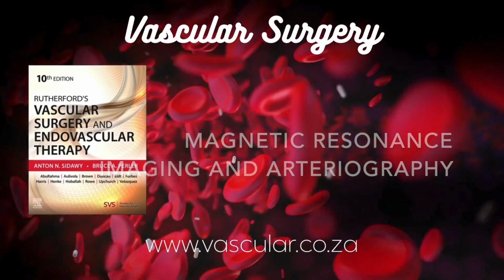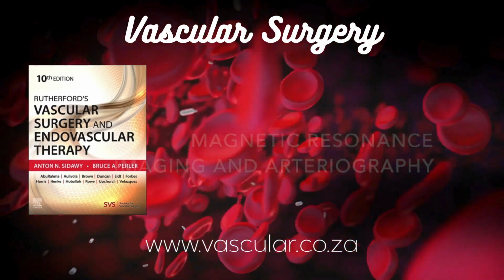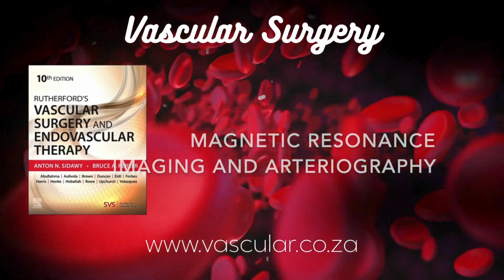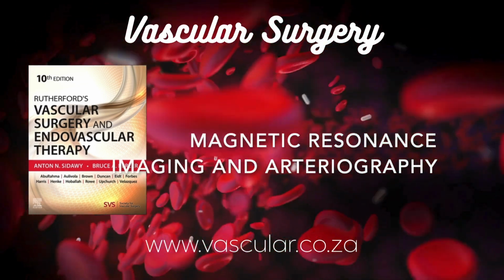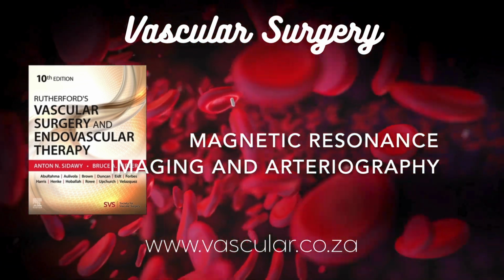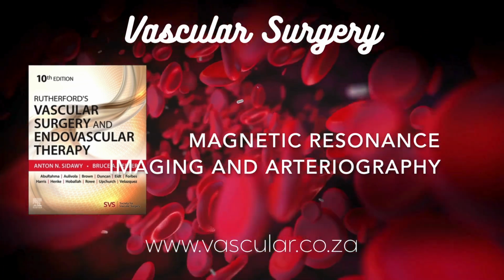The fatty lipid core, the fibrous cap covering it, areas of bleeding within the plaque, even calcification, though CT is better for calcium. Using contrast for this too. Both non-contrast techniques and specialized contrast methods are being explored. Some contrast agents might target inflammation, macrophages, or new vessel growth, neovascularity within the plaque, potentially indicating higher risk, unstable plaques. USPIOs and maybe gadofosveset have shown promise here.